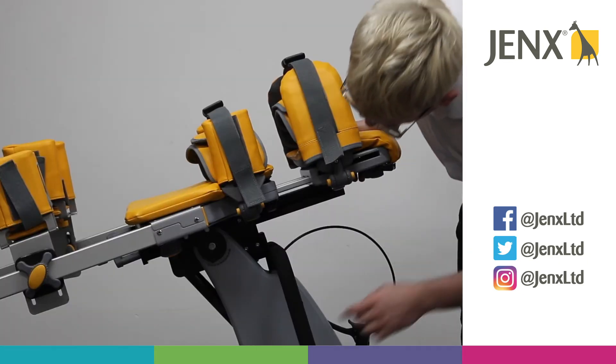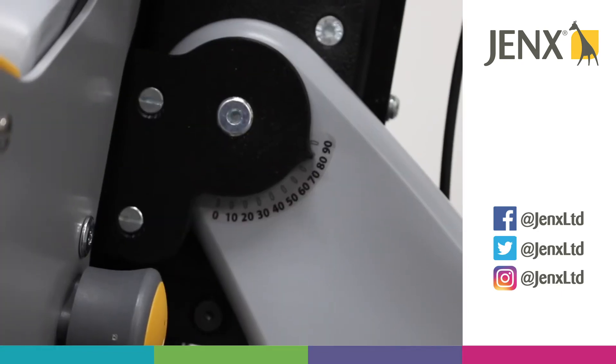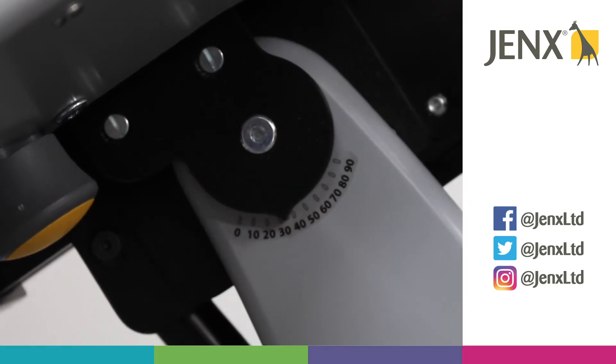On the side of the Stans, you'll be able to see we have an angle gauge to tell you what angle the tilt is at.